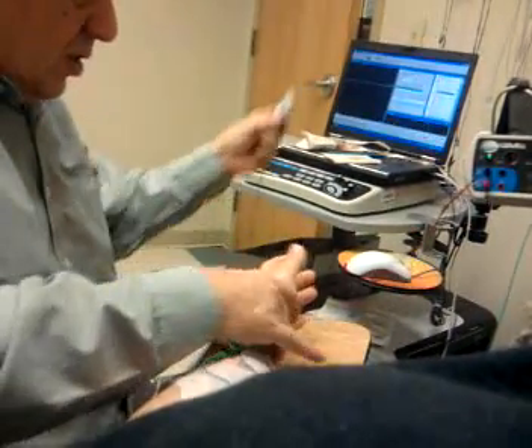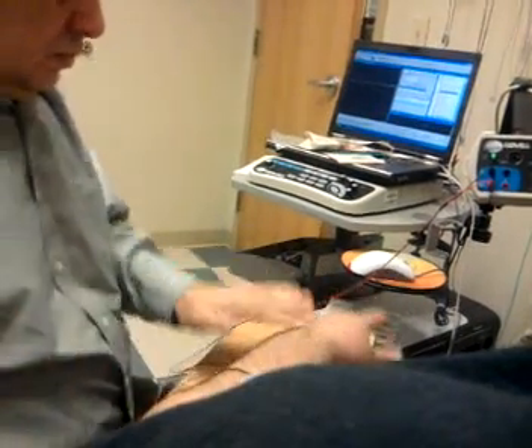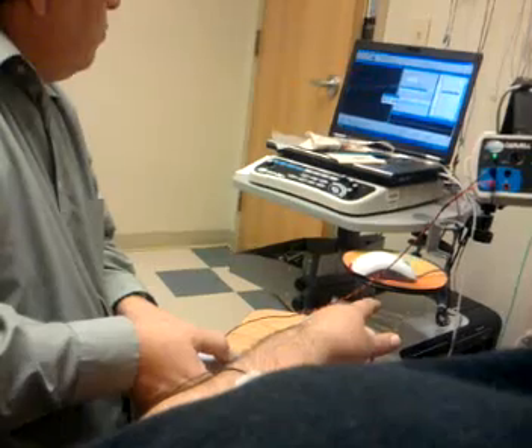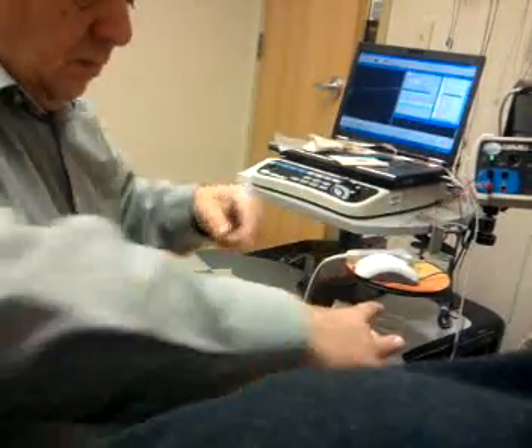And then we'll map it as it comes off the other side of your hand. And that's how we do it.